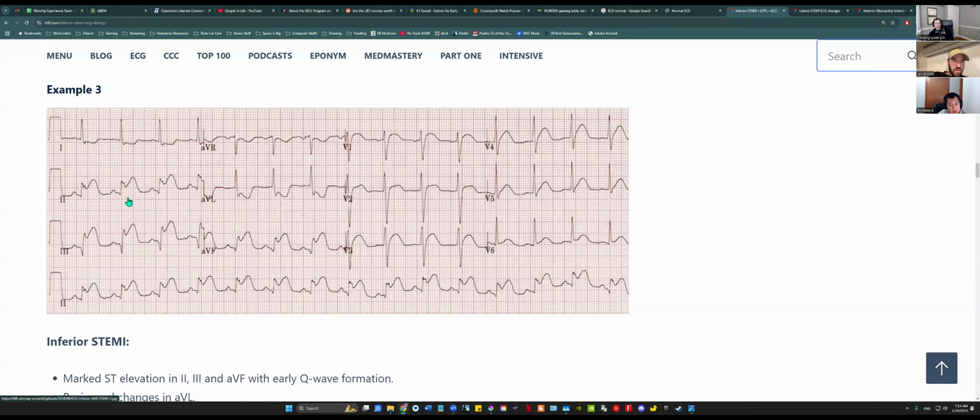It's like, oh yeah, like 6 millimeter elevation in lead three. Yeah, please come in. They'll be like, all right, cool. You sold me. I'm on my way. A lot of times, if you describe it this way, they won't even bother wanting me to send them an EKG. They're like, yeah, I'm right over. We'll activate the team.